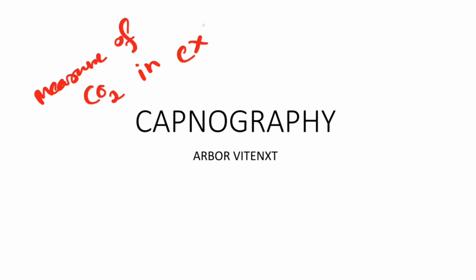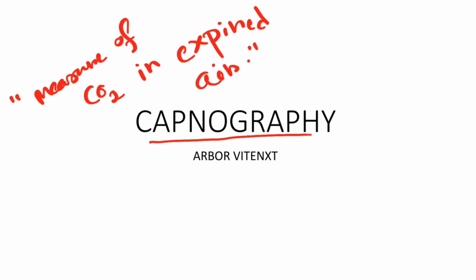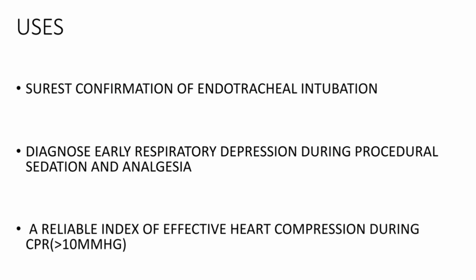Today we are going to discuss a very important topic from the anesthesia point of view, that is known as capnography. Basically, capnography means the measurement of carbon dioxide in expired air. That is the basic thing being done here in capnography. So let's begin. Before we go into further details, what are the basic uses for capnography?